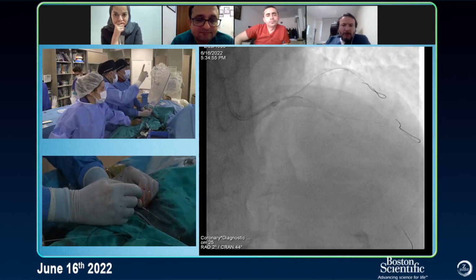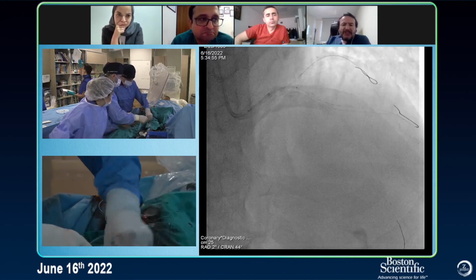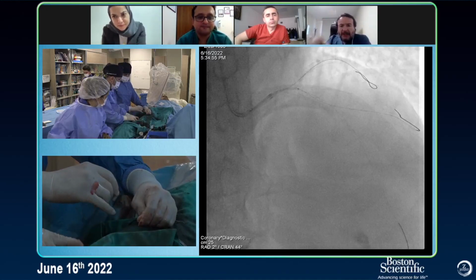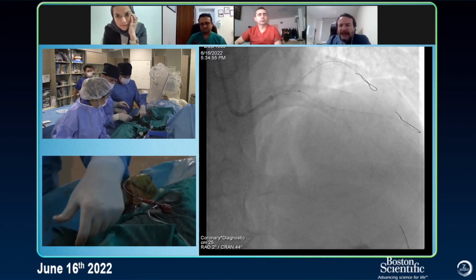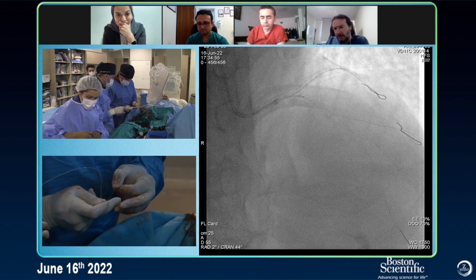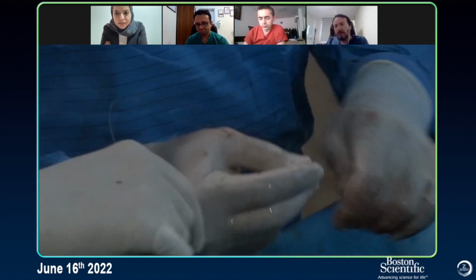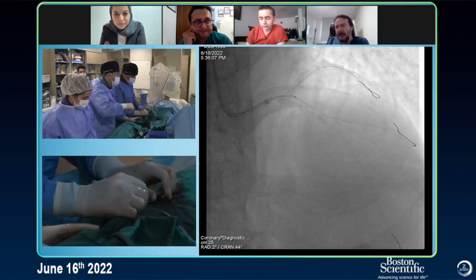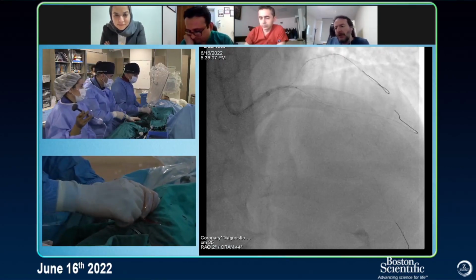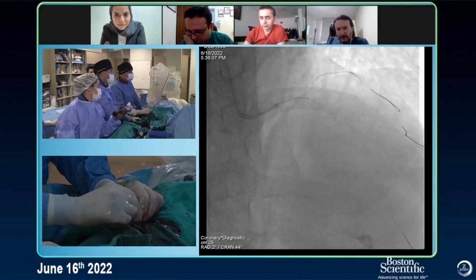Ömer, would you consider ballooning that part again with the cutting balloon, is that better? We didn't have a cutting balloon at that part. The part where you are now trying to go with your stent has not been ballooned with the cutting balloon. But I think there's a significant dissection too in that proximal. Yes, of course there is dissection, but the calcification is also coming in the way, so you cannot push it. We need a smooth way. There is lots of calcification and we break the calcification. That's why it's not easy to insert stents.